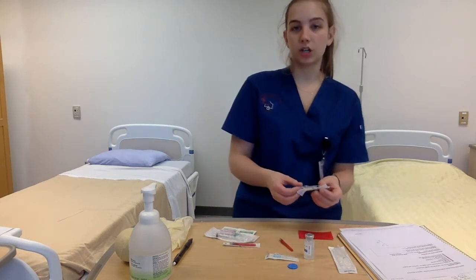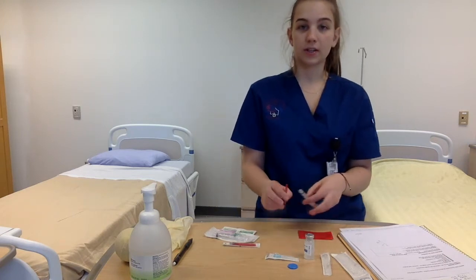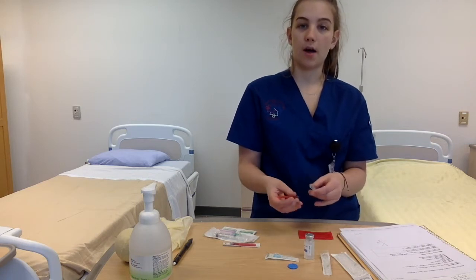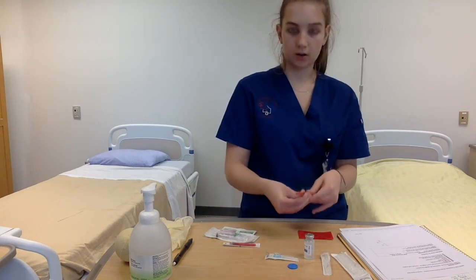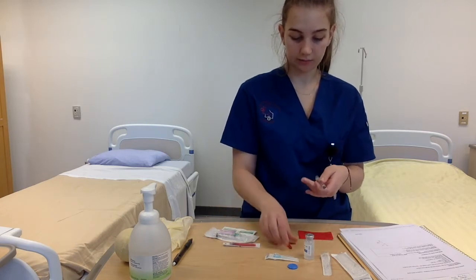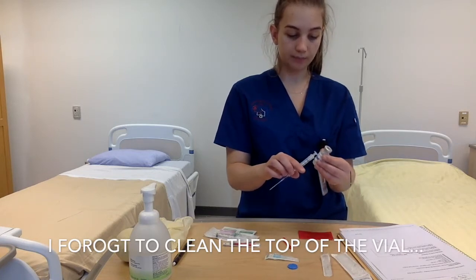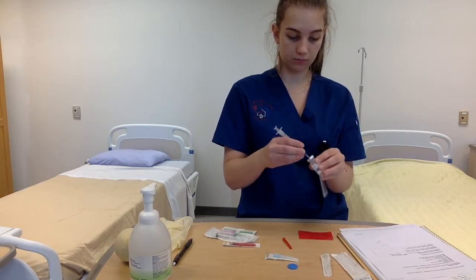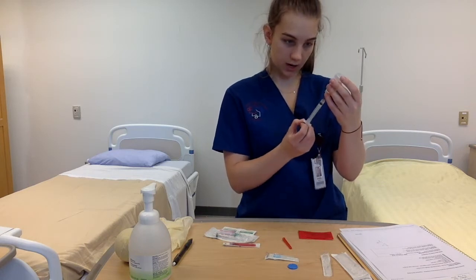And I've also made sure to check Mr. Mancini's allergies before I'm giving him any medication. So he does have one allergy, which is codeine, but we're giving him heparin today subcutaneously, so there's no conflict there. So you just start by twisting the blunt tip needle onto the syringe like this, and then carefully take the cap off, and then we're going to make sure that this is the correct medication and draw up the correct dose. So I'm going to make sure I'm drawing up 1 milliliter.